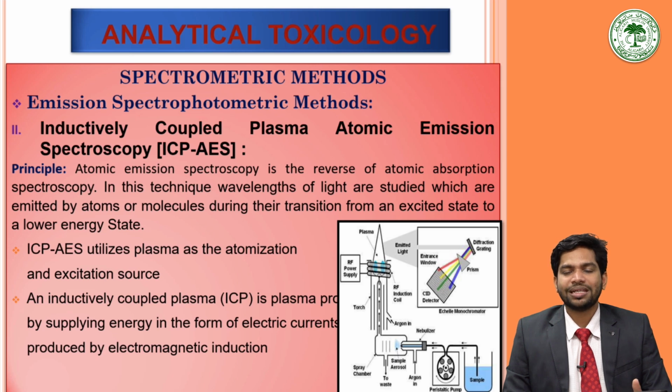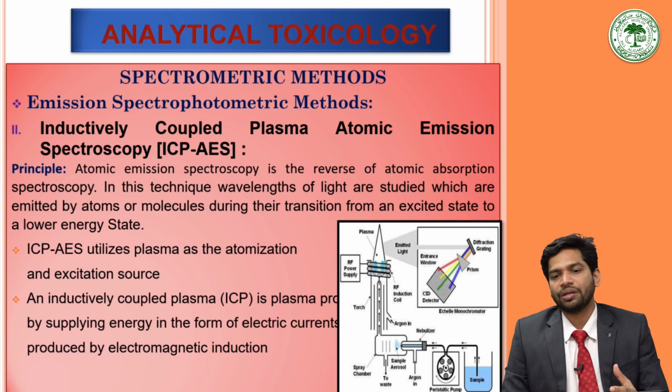Its molecules immediately collide with the electrons and charged ions in the plasma. The sample is broken down into its respective atoms, that is, atomization. Electrons in the individual atoms get energy from the plasma and rise to a higher level. As they return to their original position, they emit radiation. In the process, they give off radiation at the characteristic wavelength of the elements involved. This radiation is studied to derive the composition of the metal.